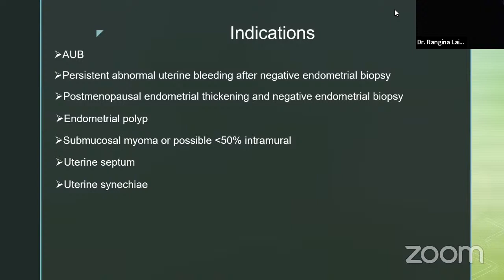Then uterine synechiae, Asherman syndrome. Recently we had a case of Asherman syndrome, but we could not repair that case because there was zero visualization of the uterine cavity. We even put the scope from above laparoscopically, but we could not repair that case.